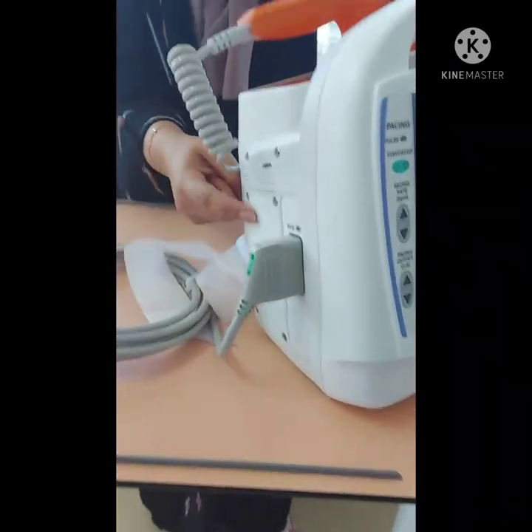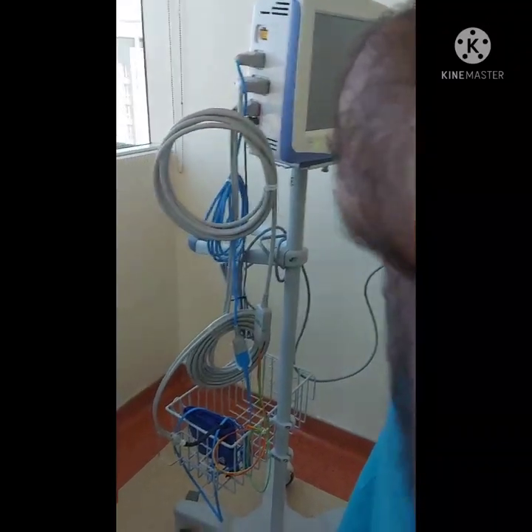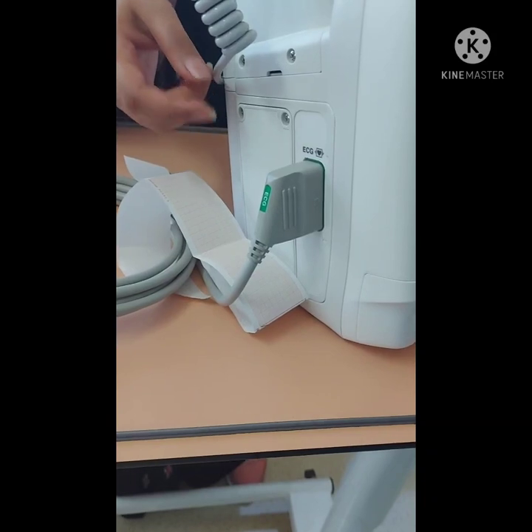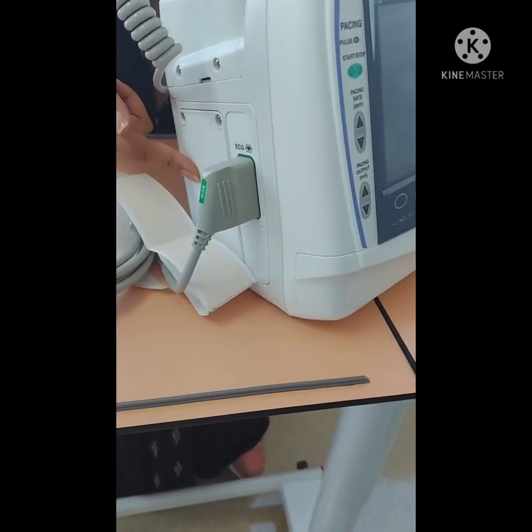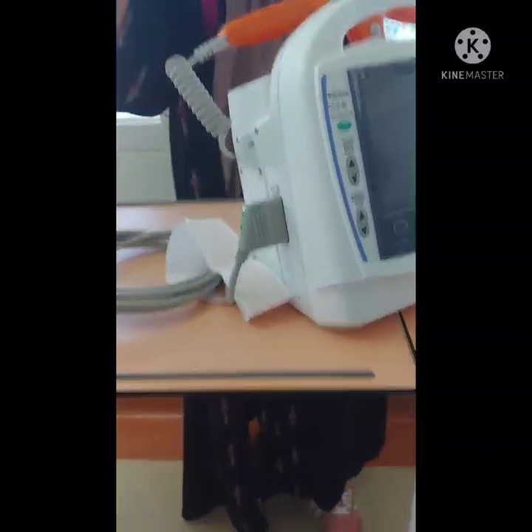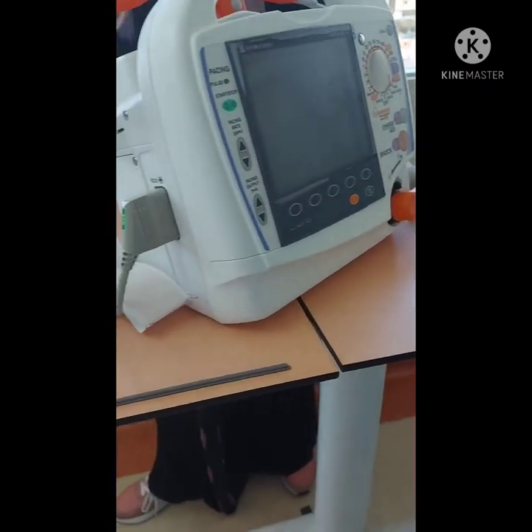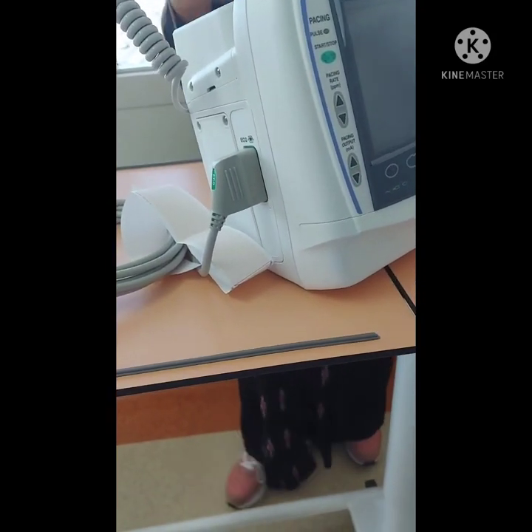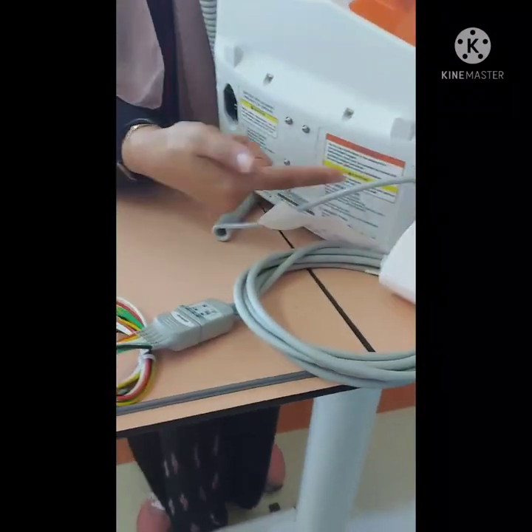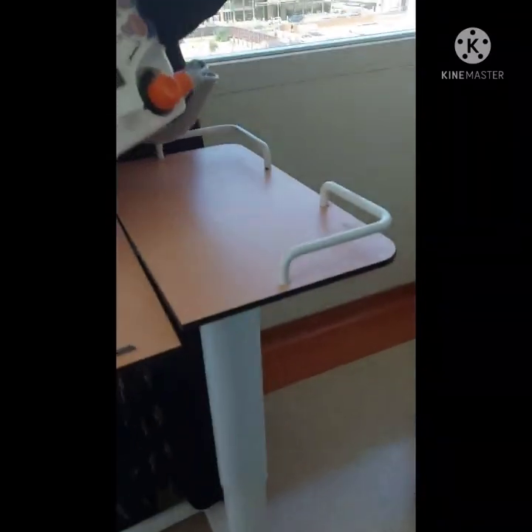For here, there is nothing right now, but next week you will have an SpO2 port like this one, exactly, with the adapter itself. You will attach it here. This part is going to be opened, and then the same one. Because they requested it with the SpO2, but we don't have the module in Khobar. So they are bringing the module from Jeddah and they will install it here. So it's going to be with an SpO2 also. So ECG and SpO2. In the future, you can also add CO2 if you want. The ports will be there, but you just have to purchase the adapter itself. From the back side, you just have the two batteries in here and the power plug.